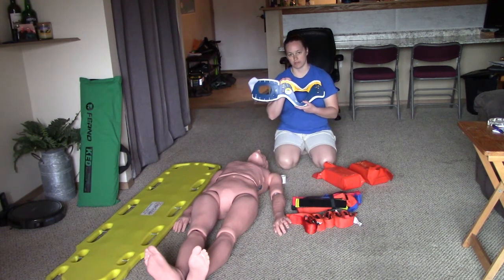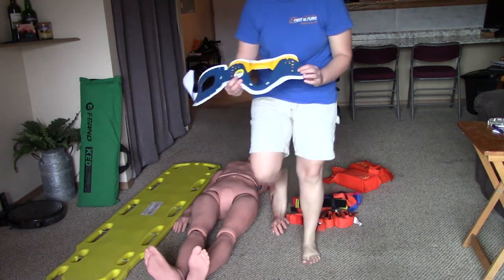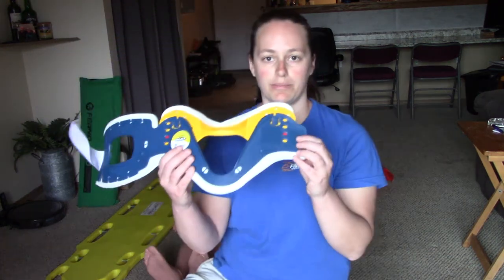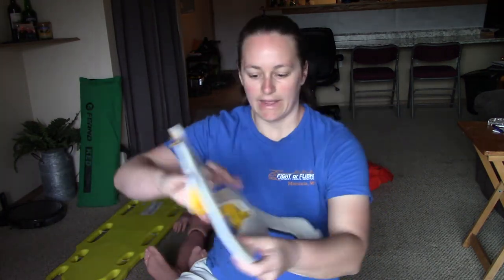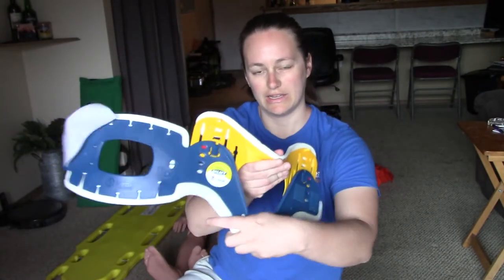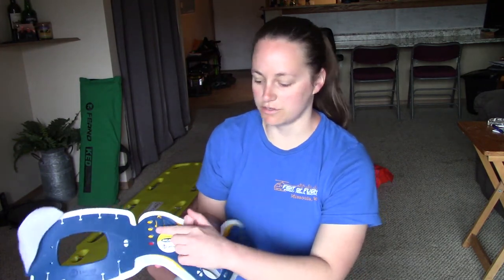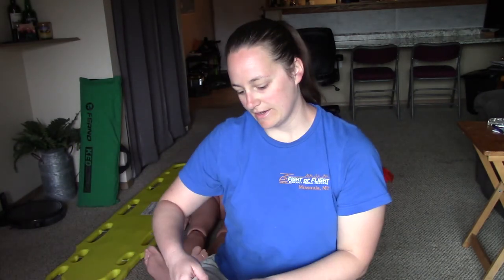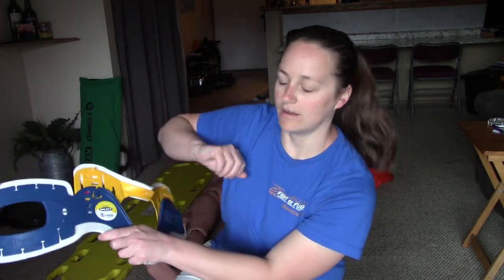We also have our cervical collar or C-collar, which we can adjust to the patient. As you measure your C-collar, you'll notice most of them have a push-to-lock button on either side, and on the back you can push the button to unlock and adjust the C-collar. There are four sizes: tall, regular, short, and no neck. You measure your patient's neck using your fingers from the top of their trap to the bottom of their jawline, then lay those fingers on the C-collar to determine what height you need.